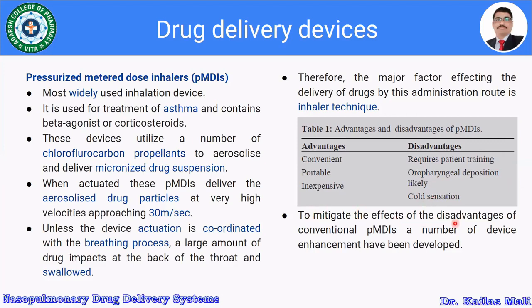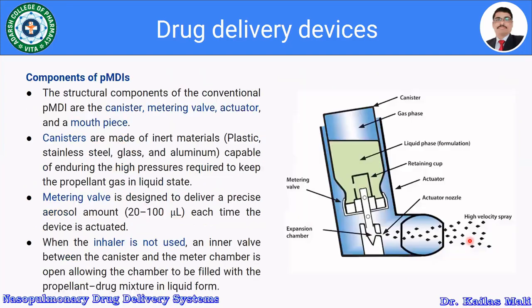To mitigate the disadvantages of conventional pressurized metered dose inhalers, a number of device enhancements have been developed. So let us see the remaining part of the pressurized metered dose inhalers.